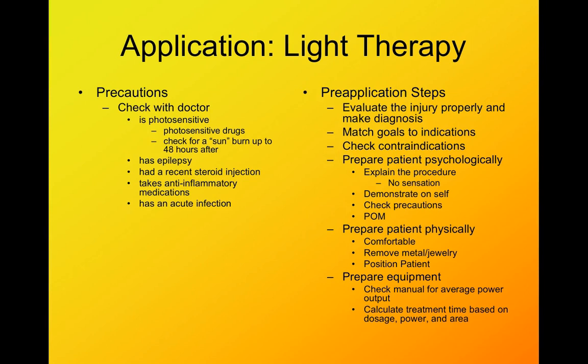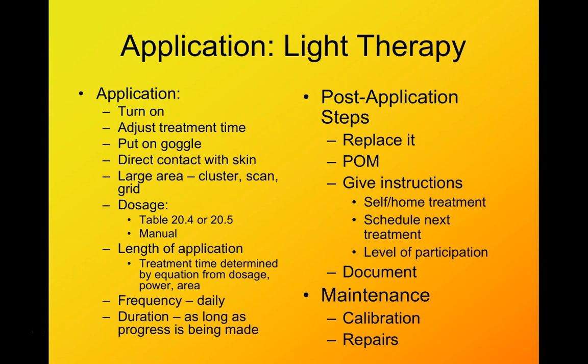There is some research that actually you could do some cryotherapy beforehand, which would decrease the blood flow and potentially help with the depth of penetration of the laser. But that's one study, so it's not necessary, but it might be something you see. You also want to clean the skin with soap and water or with alcohol swabs and make sure it's dry before we do any treatment. That will help with the penetration as well. You'd also figure out what type of application you're going to do and make sure that the area that you need to treat is exposed.